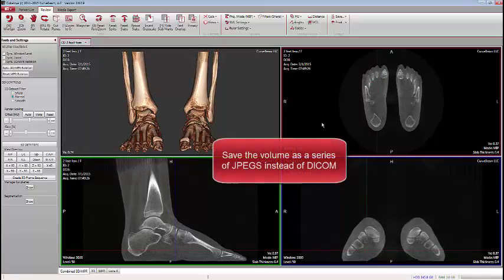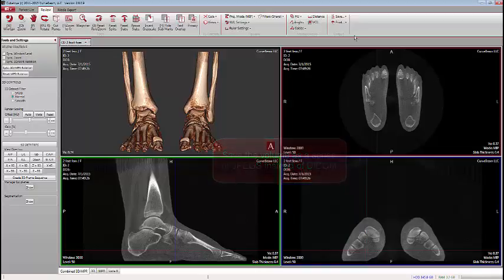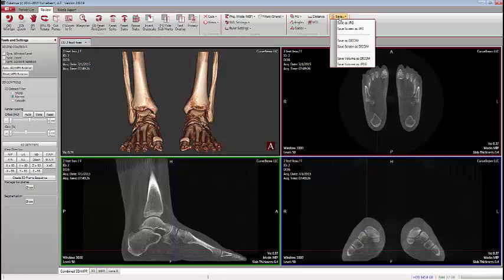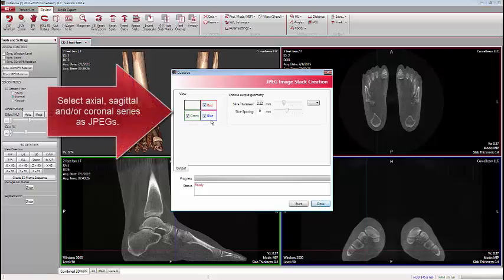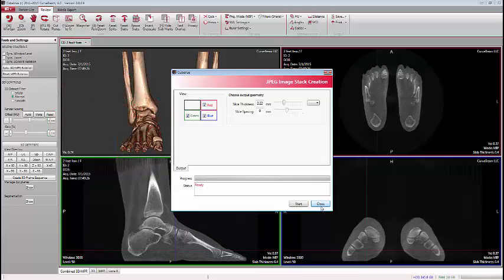There have also been requests to save the entire volume of images not as DICOM but as JPEG images. If you go to Save and select Save Volume as JPEG, you have the ability to save either the axial, the coronal, the sagittal, or all three series of images as JPEGs to review in a different type of software.